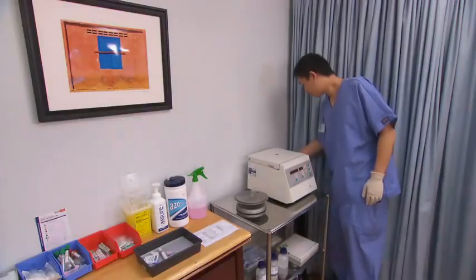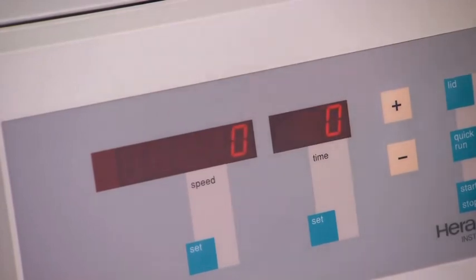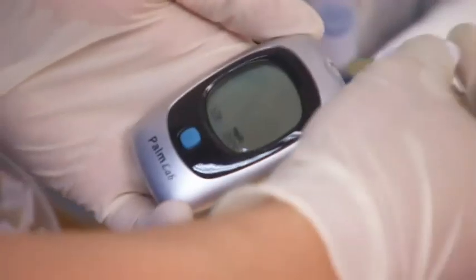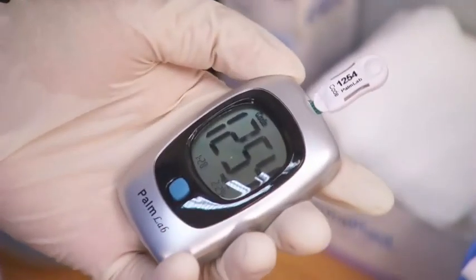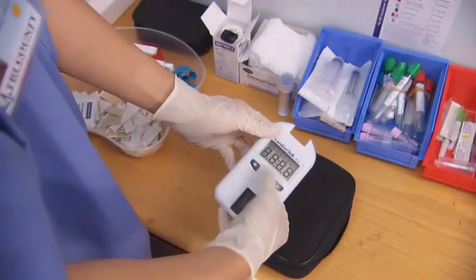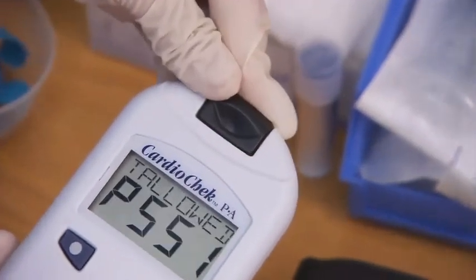At the beginning of the day, switch on and check the micro-hematocrit centrifuge, and switch on and check the glucose monitor. Perform quality control checks as per the manufacturer's instructions. Inspect the test strip before using it and insert it into the glucose monitor. Turn on the cholesterol testing device and perform quality control checks as per the manufacturer's instructions.